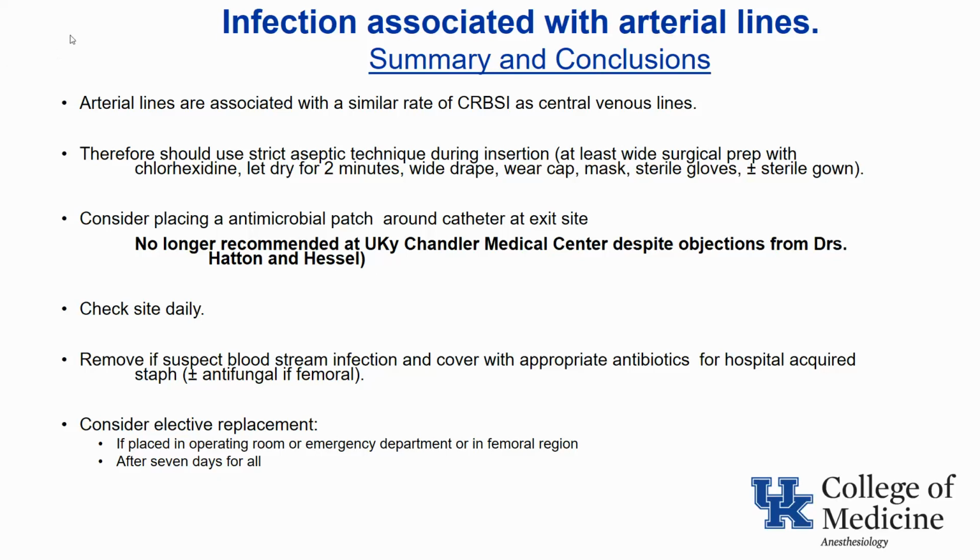In summary, arterial lines are associated with similar rates of infection as central lines when placed in critically ill patients for similar lengths of time. On the other hand, if placed in healthy patients for only a day or so, then the incidence of infection is very low.